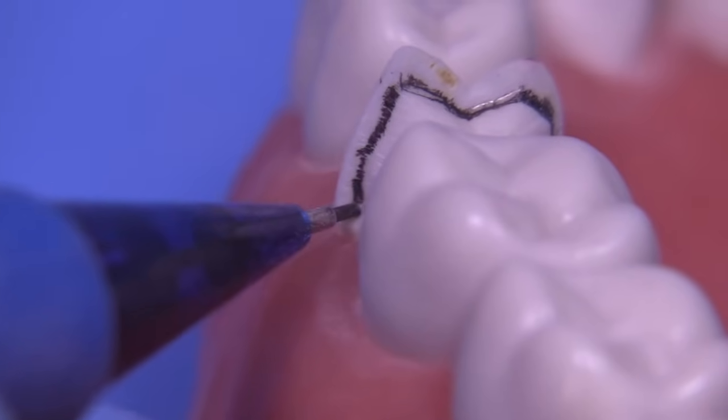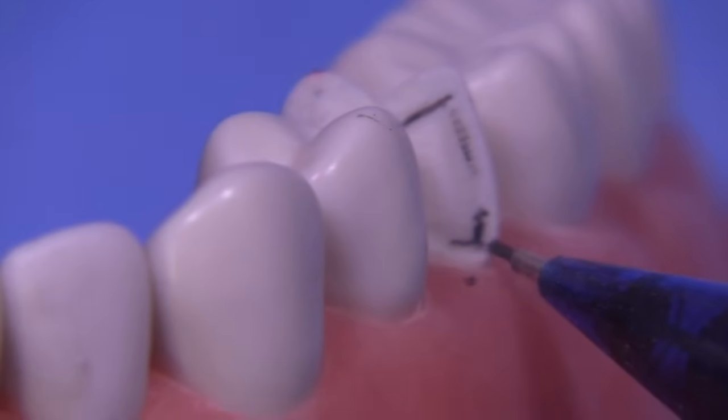You can see that little bump in the middle of the facial — that gives a really good idea of where we need to make some adjustments.